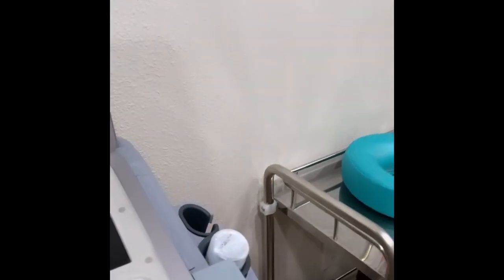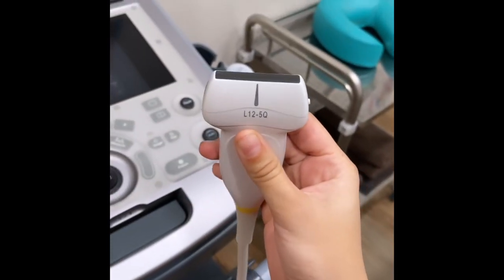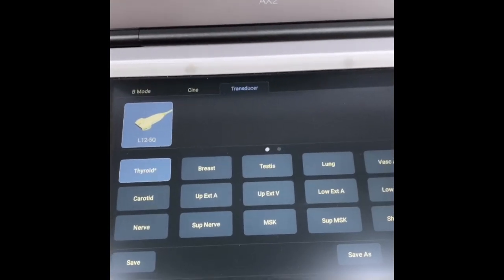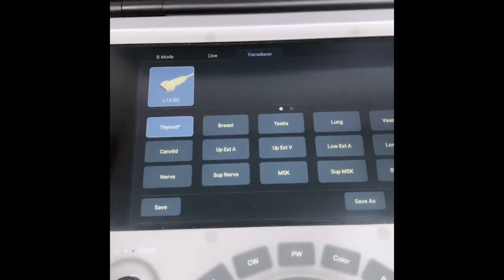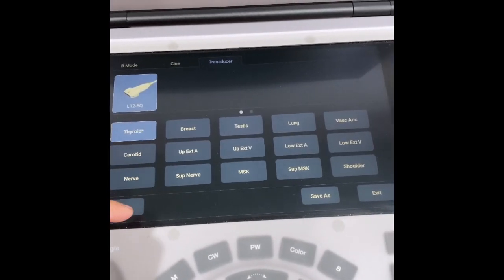When setting up for an ultrasound, it is important to select the proper transducer — a linear transducer is ideal for this protocol. Another important aspect is to be set up in the proper settings, which for this protocol you will click your transducer, then go to small parts, and then click thyroid.